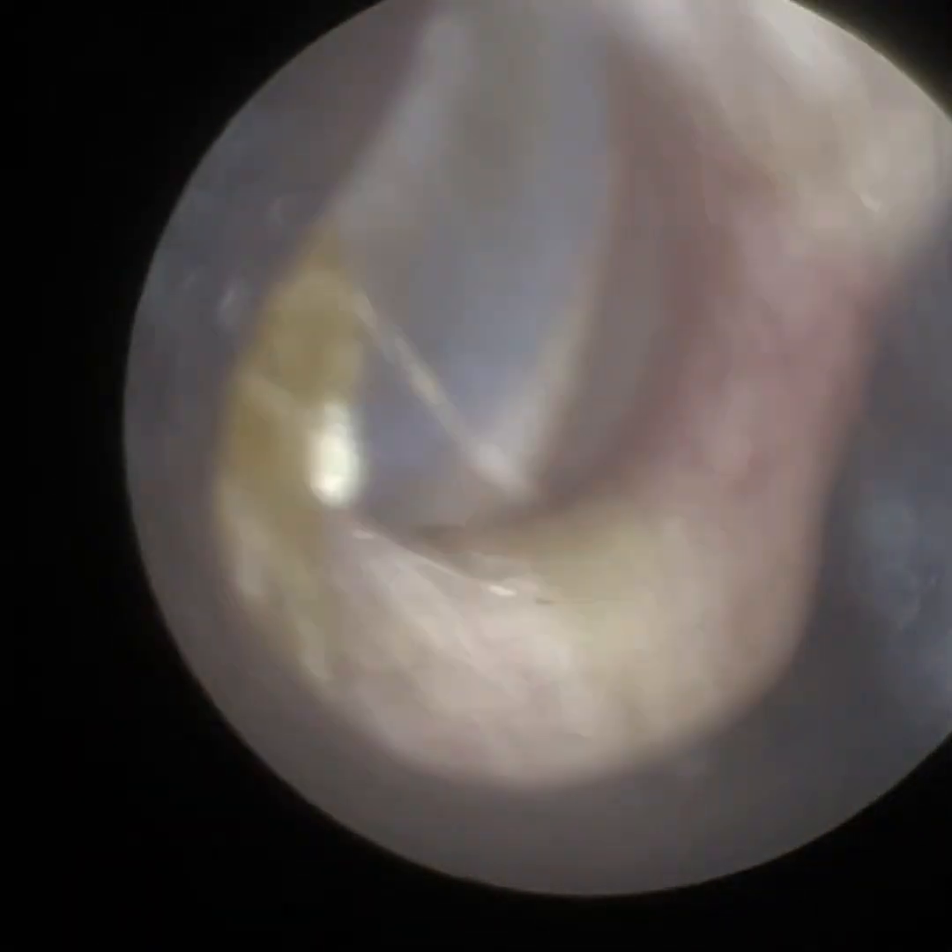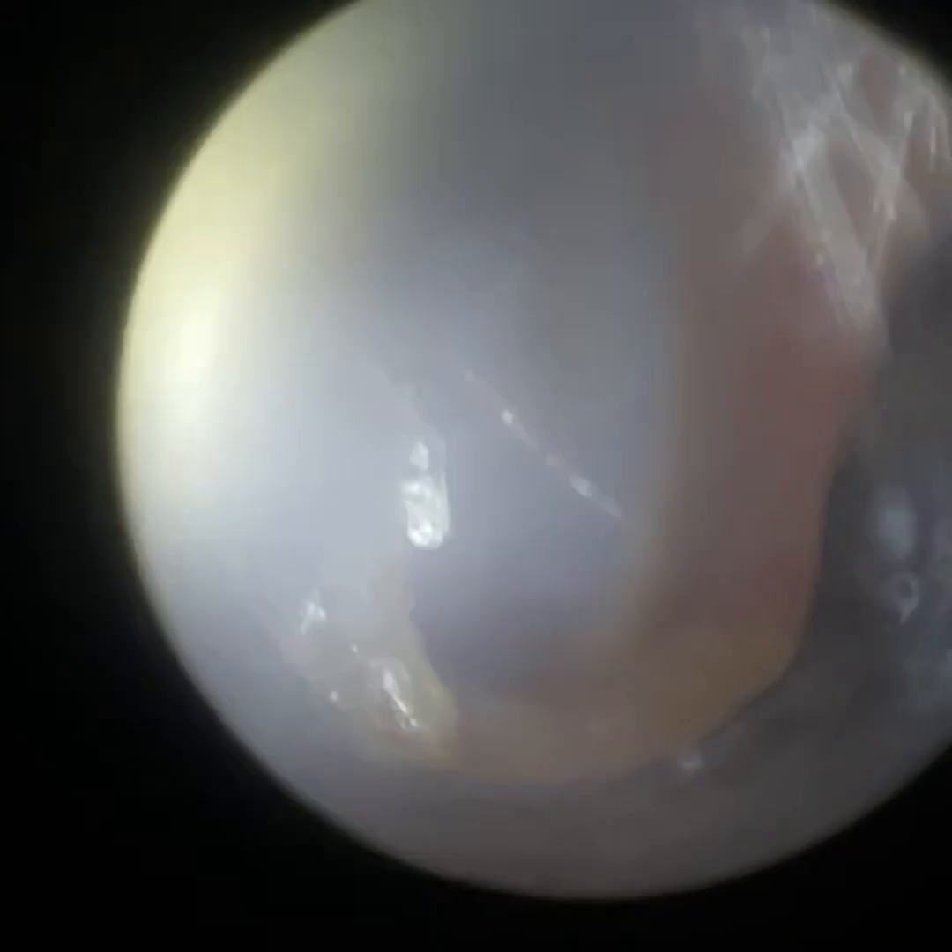What's really interesting in this case — and you'll see it in a moment once I remove this residual keratin and wax off the anterior canal wall — is that this patient is suffering from eustachian tube dysfunction bilaterally, but in their left ear, the eardrum is retracted so much that it's wrapped itself around the long process of the incus.